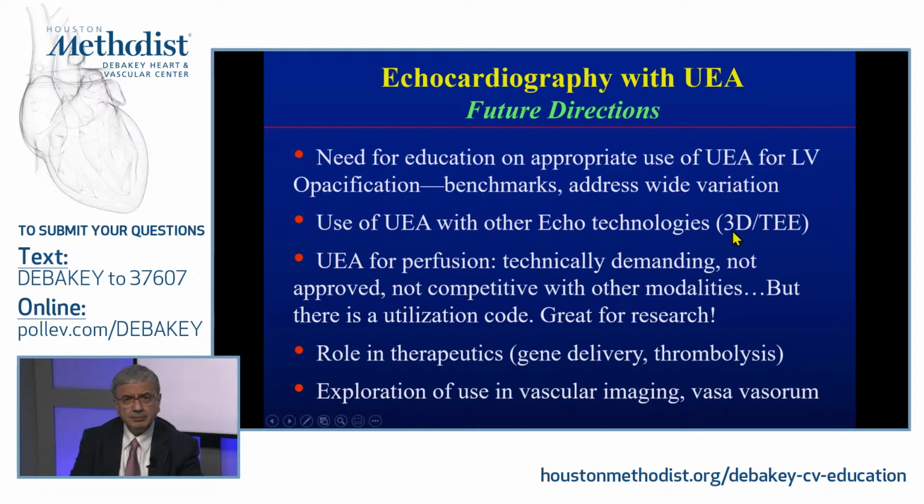So we want to optimize utilization as well as visibility, so that in technically difficult patients you can do 3D volumes of the ventricles, left as well as right, as well as ejection fraction and regional function. So we implore our industry partners to improve this pairing, or marriage, of these two techniques, contrast as well as imaging.